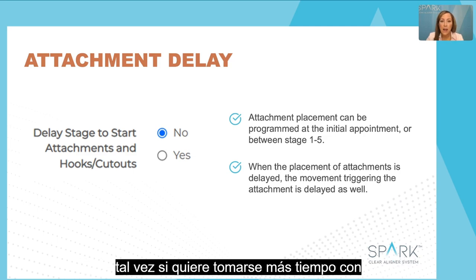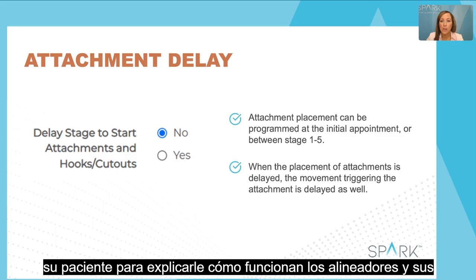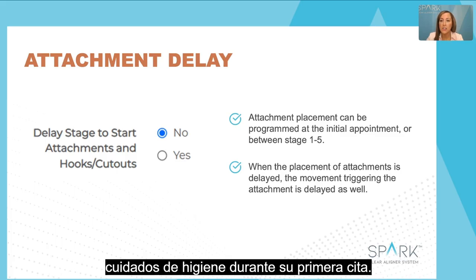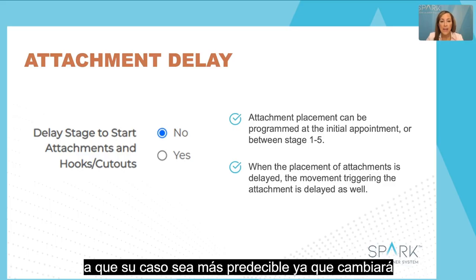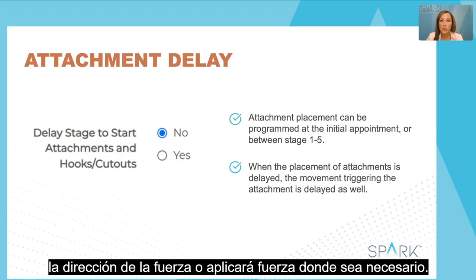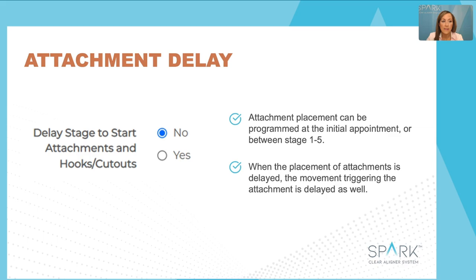Maybe if you want to take more time with your patient to explain how aligners work and their hygiene care during their first appointment. It is really important to specify that you want to delay the placement of attachments and the stage you want them to occur. However, as we know, attachments are really going to help you make your case more predictable, as you will change the direction of force or apply force where needed.